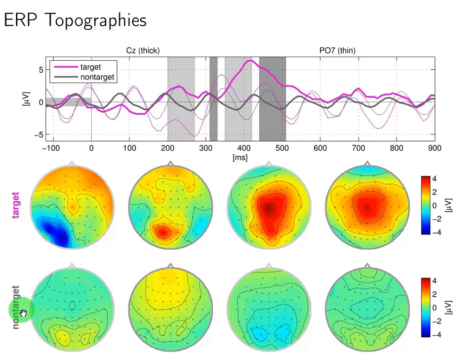What we see here is that they are different. Target has this kind of distribution, while non-target does not. Second, we take another time segment of interest, average it, and plot it through interpolation. Then a third one, and a fourth one. We can also generate a fifth or sixth. So these four different topographies correspond to the averages of successive time segments.